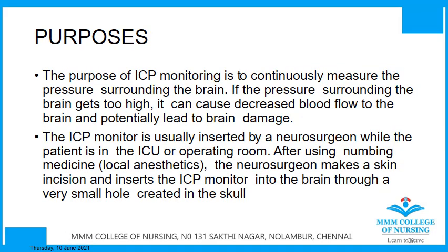Purposes. The purpose of ICP monitoring is to continuously measure the pressure surrounding the brain. If this pressure gets too high or if it gets too low, then there is a high chance of brain damage. So what happens here, the ICP monitor is inserted by a neurosurgeon, and this happens in an ICU or an operating room. He does this with a numbing medicine. The neurosurgeon makes a skin incision and inserts the ICP monitor into the brain through a very small hole or bore which is created inside the skull.